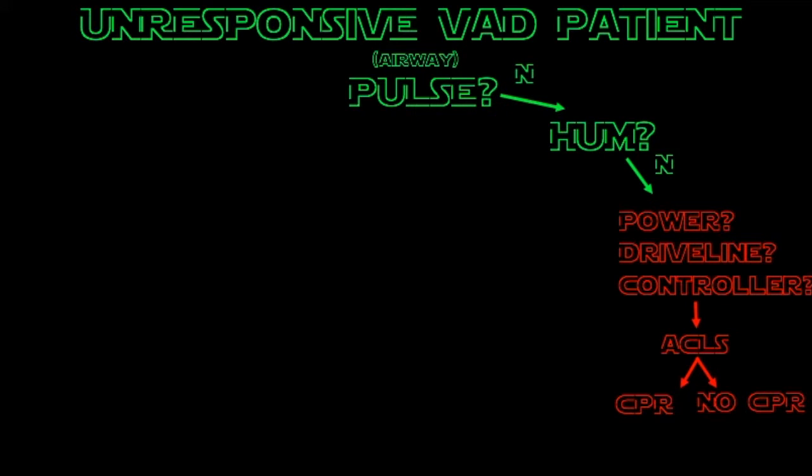While there's no evidence that chest compressions lead to VAD dehiscence, it's probably best to follow your institution's protocols if you have them in place. If you are a no compression center, you'll have to proceed with a chemical code.